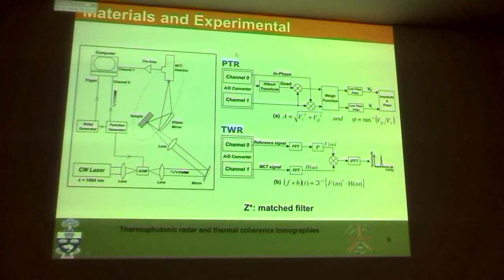What I'm describing here is a lock-in amplifier, because the lock-in amplifier does exactly that. It mixes the signals, and it picks up the signal component that corresponds exactly to the frequency of the excitation. So it's a mixer and a low pass filter. It gives you information out of the DC. It sends everything to DC. So even though you put an AC there, you have two DC signals, an amplitude and a phase, coming out of a lock-in amplifier. And you can do that also for the entire chirp, because the lock-in fixes one frequency at a time.